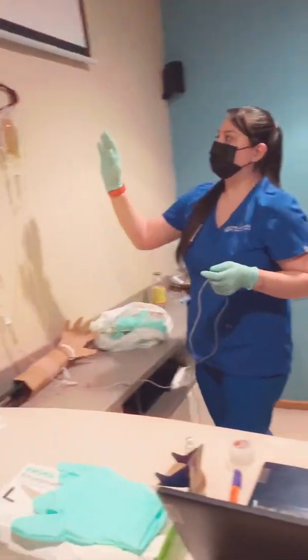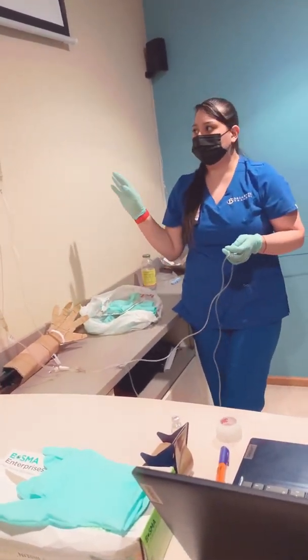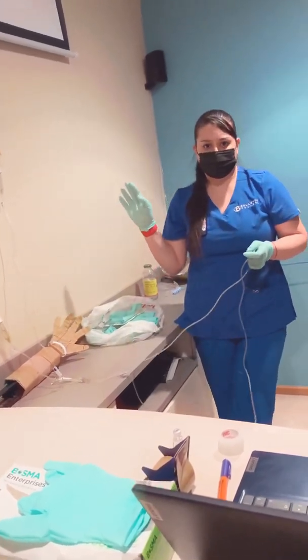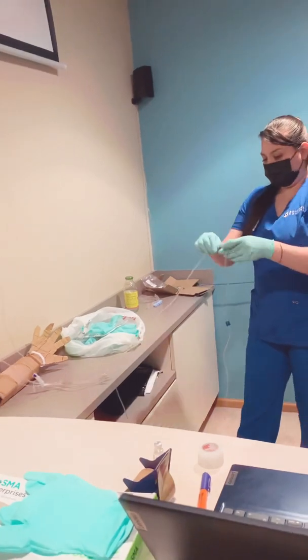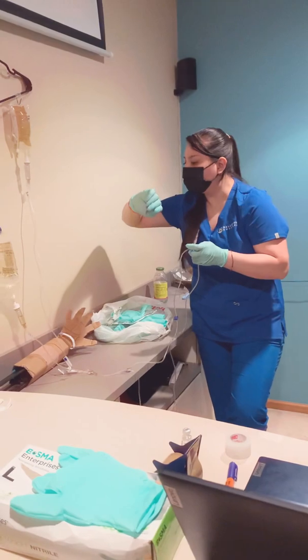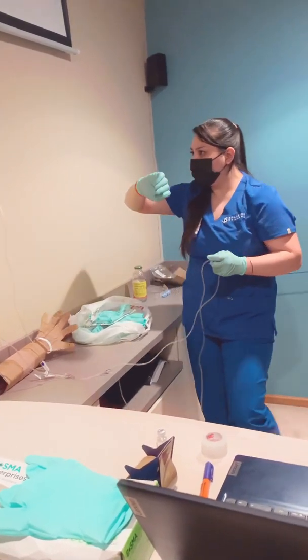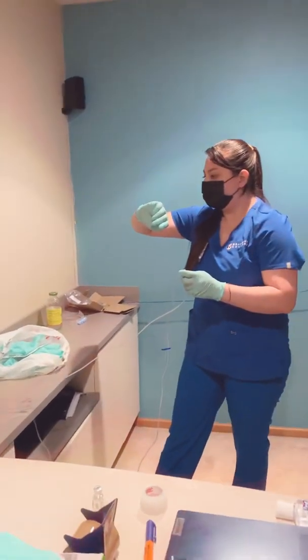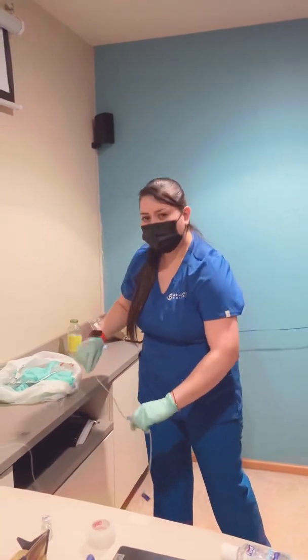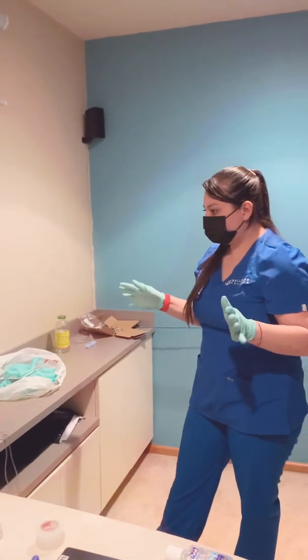And the rate for the cefazolin is 33 drops per minute. I'm going to calculate it by 15 seconds, so that would be 8 drops per 15 seconds. So here we go. I'm going to grab my roller here. 15 seconds, 8 drops. Okay, looks good. All right, so everything looks perfect.